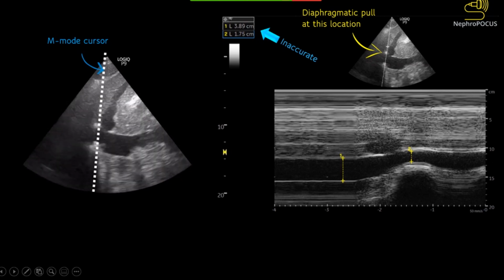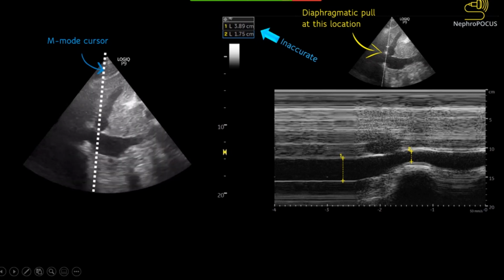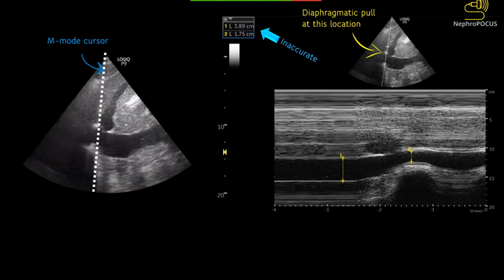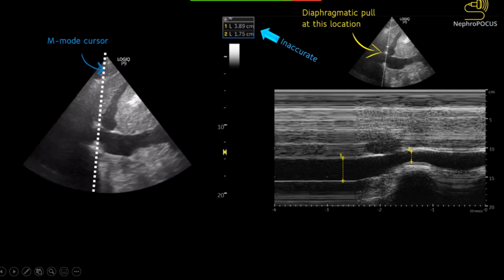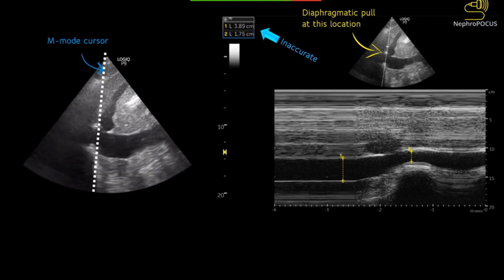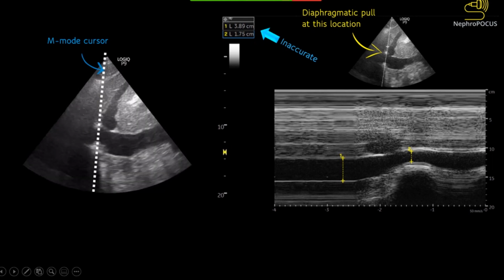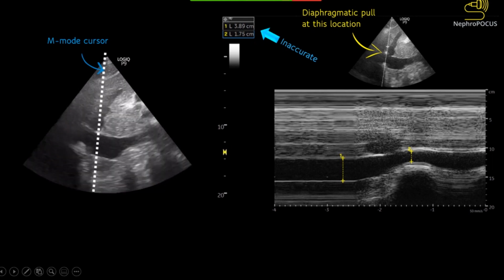So for example, you can see the M mode cursor here. Initially, we placed it at the place normally we would want to measure, that is just below the inferior vena cava hepatic vein junction. And when the patient takes a deep breath, that point is changing and the line is almost coming to the inferior vena cava right atrial junction. And what's there at the inferior vena cava right atrial junction is the diaphragm, and there is always some pull exerted by the diaphragm. So when you are not measuring the same point here, look at this M mode trace on the right side.